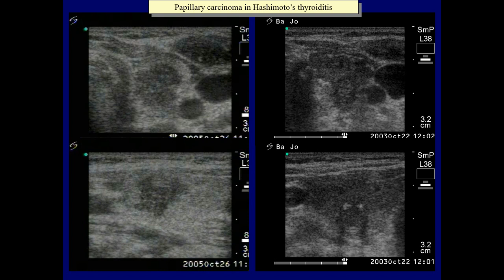Again, two cases of coexisting papillary carcinoma and Hashimoto's thyroiditis. In the left case, there is a relatively large hypoechoic lesion with lobulated margins in the central part of the left lobe. Although the irregular shape and borders can be considered suspicious for carcinoma, similar hypoechoic areas are not infrequently found in Hashimoto's thyroiditis. Note the smaller hypoechoic areas in other parts of the lobe. The right case presents a more diffusely hypoechoic lobe which contains a lesion with a slightly different echostructure: it is more hypoechoic and contains hyperechoic granules.